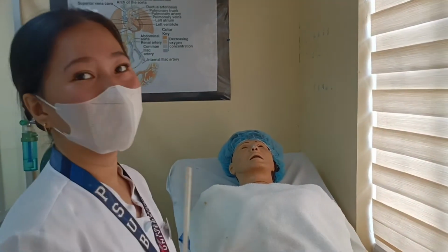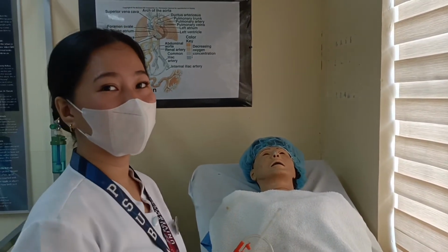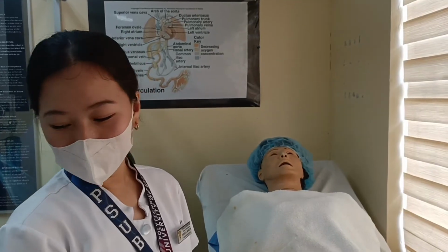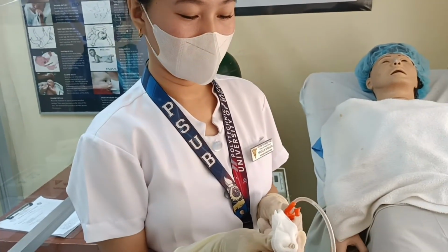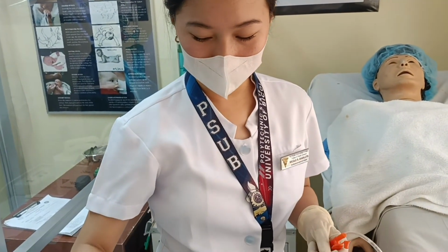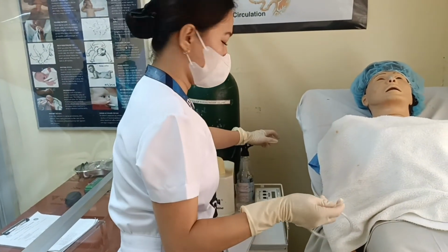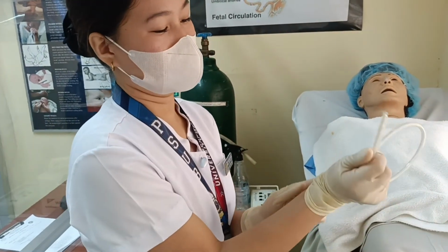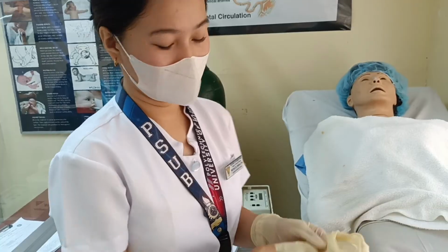Then, if ever na may natirang secretions, pwede nating ulitin yon, basta may interval na 20 to 30 seconds. So, after that, we are going to wipe the catheter. Let's assume that this is sterile. Then, discard. So, remove. Then, we are going to discard.